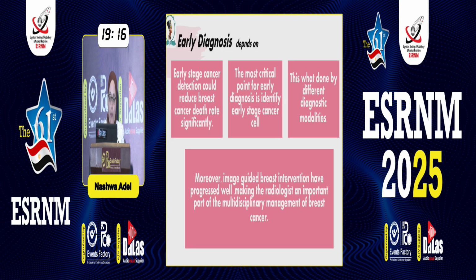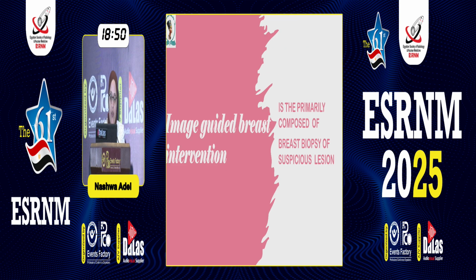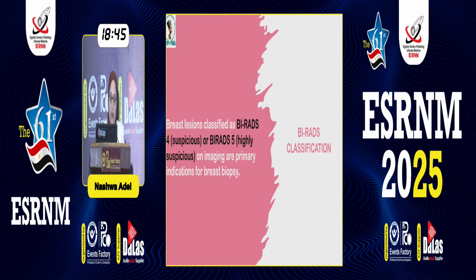This would be done by different diagnostic modalities. Moreover, image-guided breast intervention has progressed well, making radiologists an important part of the multidisciplinary management of breast cancer. Image-guided breast intervention includes breast biopsy, tumor localization, therapeutic intent, and palliative intent. It is primarily composed of breast biopsy for the suspicious lesion, which is BI-RADS 4 suspicious or BI-RADS 5 highly suspicious on the imaging.